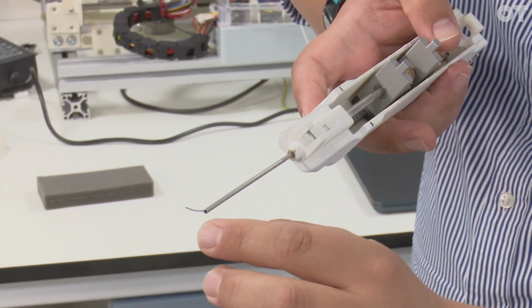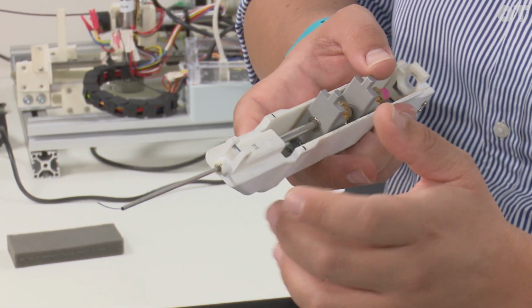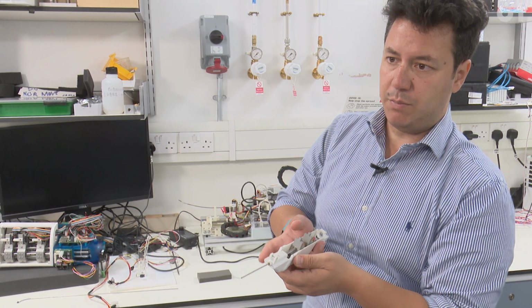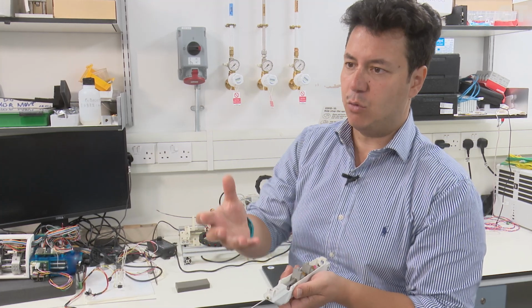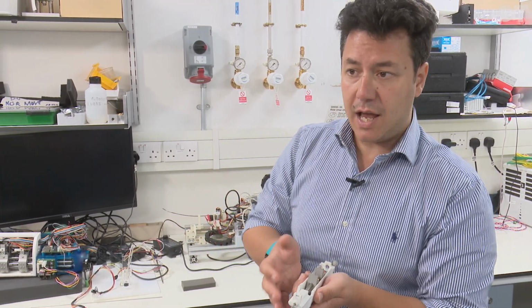And so ultimately this thin bit here at the tip is what's going to enter the patient's eye, and depending on how I reorient and control these flexible tubes, I will be able to offer the surgeon dexterity as if they had their hand inside the eye. So they could delaminate any way they want, they could do an injection any way they want.